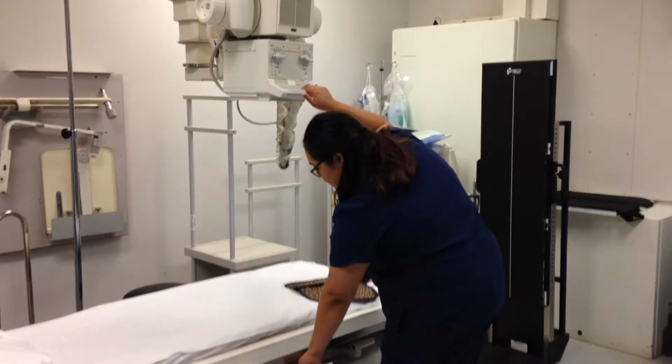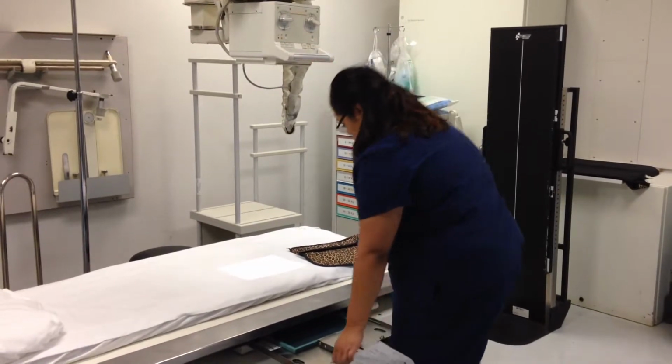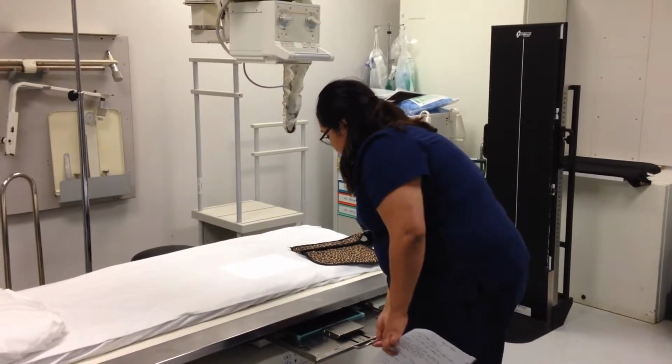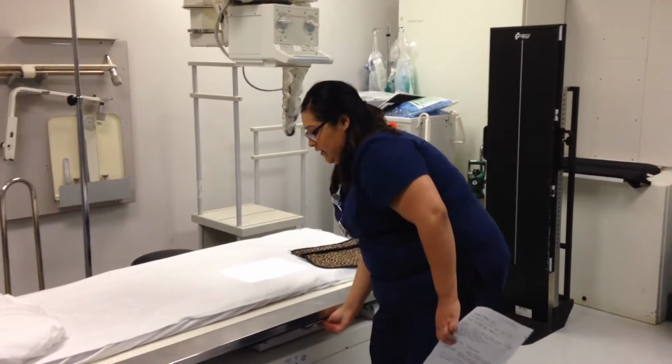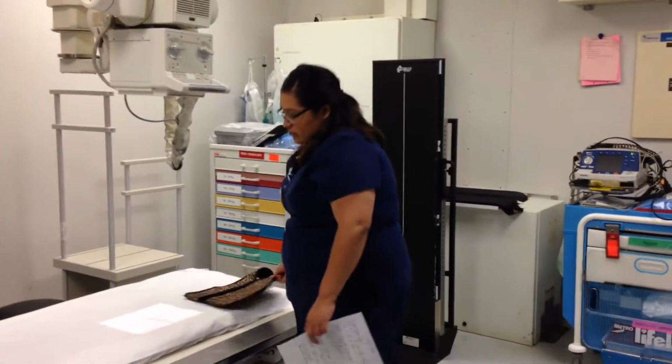And we want to make sure our bucky is aligned, our IR is aligned, so the tube will probably be changing it afterwards because we're using some tube angle today. And we have a shield here ready to go, and we're going to my patient.